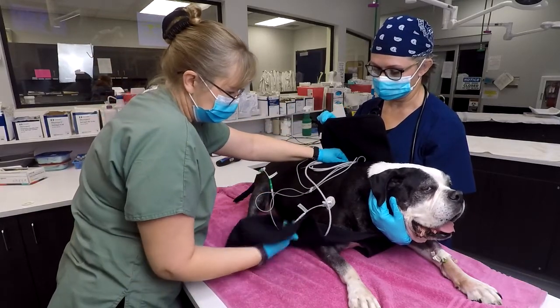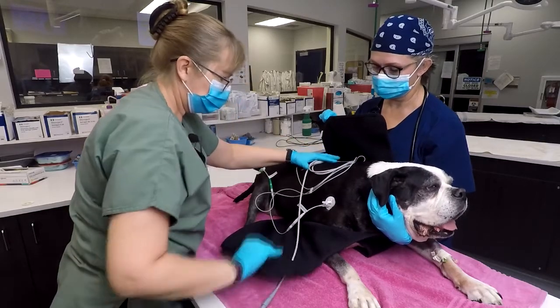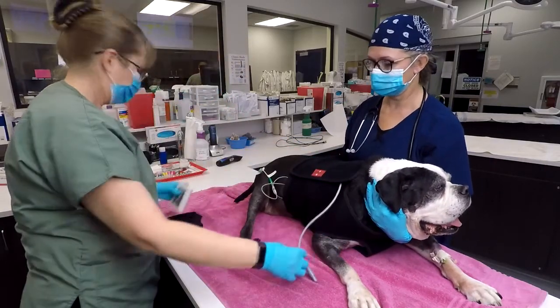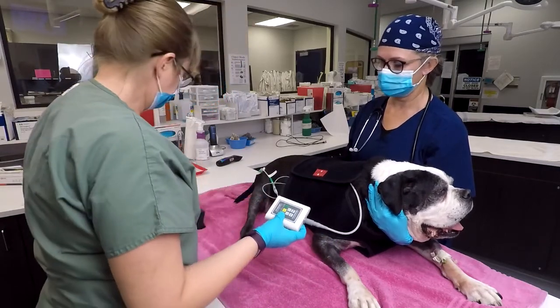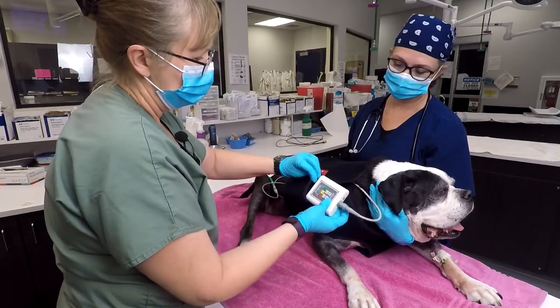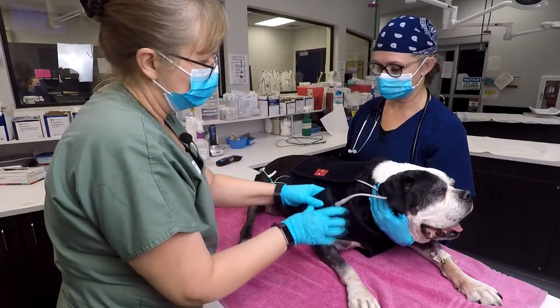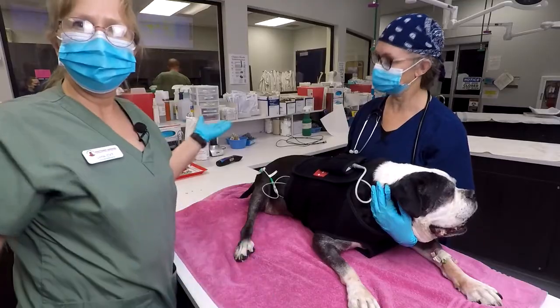All of this cable can be coiled up underneath the jacket. Feed it through the little opening in the vest, close the vest, attach the unit, and turn it on in preparation for attachment to the computer monitoring system. Then it goes into its little bag — close the velcro strap — and it attaches to the back side of the dog. Now we are good to go.